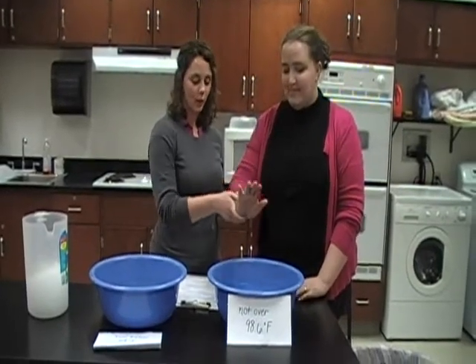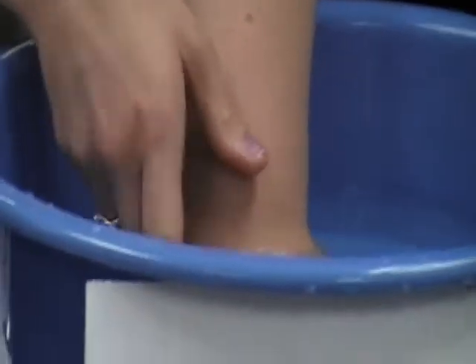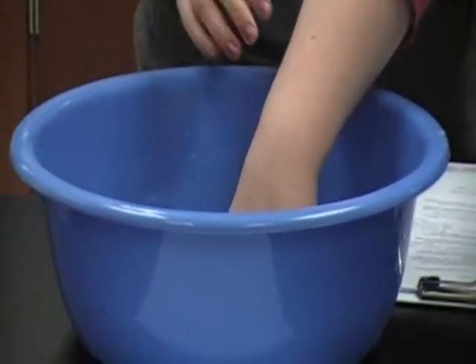You start out putting the hand in the warm water. You keep it in the warm water for three minutes, and then you remove it and place it in the cold water for one minute. You repeat this four times, and you end on the cold water.